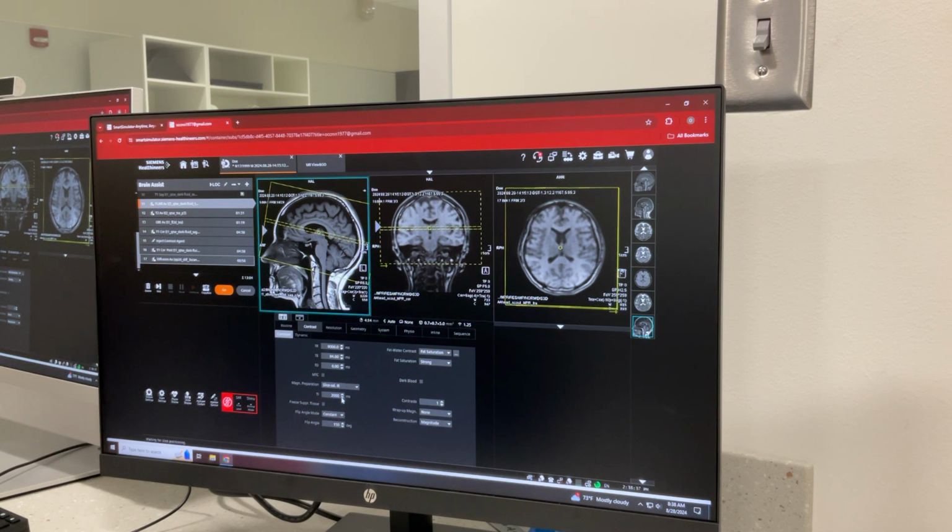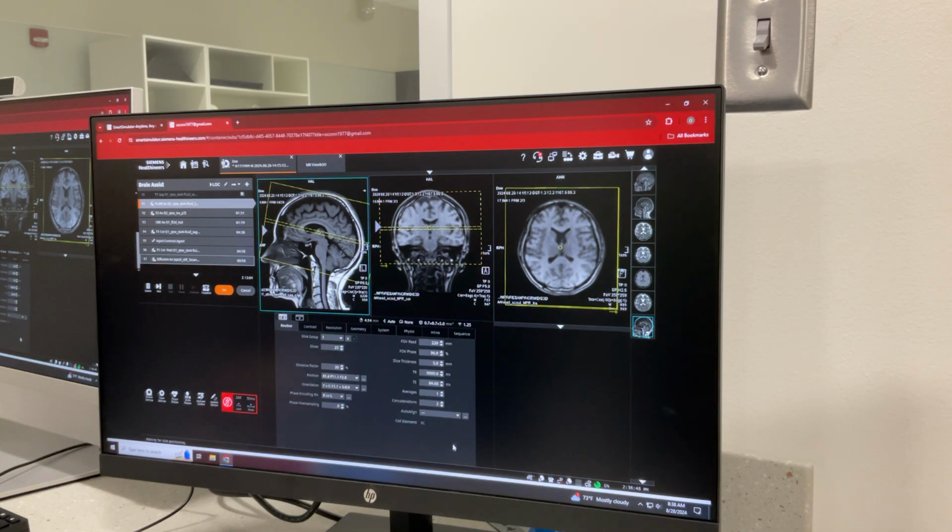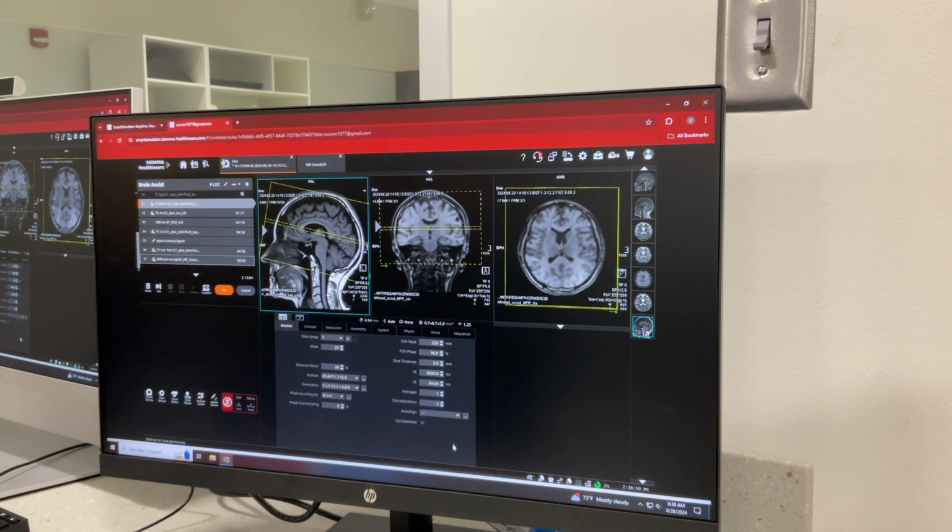Okay, thank you. Exactly. I'm not asking you to change your TR and TE, but what are they? 9,000. Yep. It's a long TR and it's a long TE, right? And yeah, that one's just a little bit of a glitch, and it won't let you change it. I should have written down which licenses I've used for which, so I know which one it is.